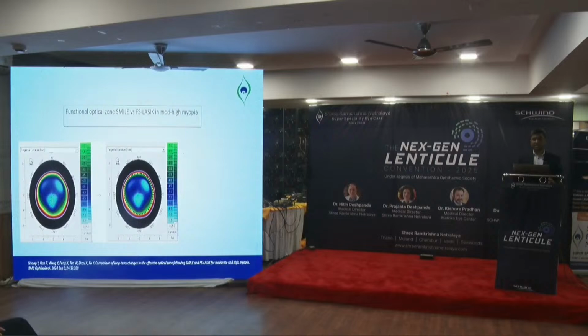In this study they prospectively followed patients over a period of 3 to 7 years, and in both groups the functional optical zone does reduce, but it is always larger than in femtosecond LASIK. So the visual outcomes are much better with lenticule refractive surgery compared to femtosecond LASIK. And in the long run, femtosecond LASIK does induce spherical aberration in the post-op period.